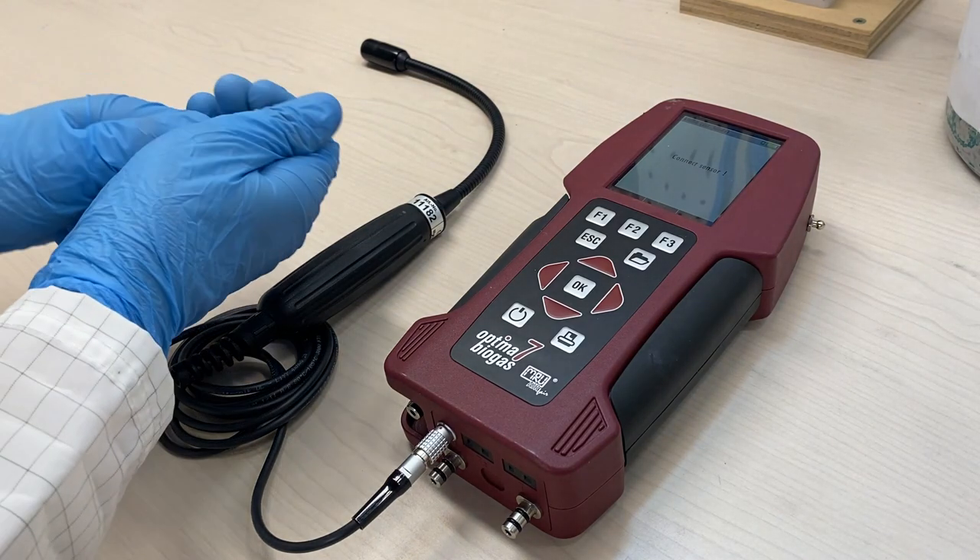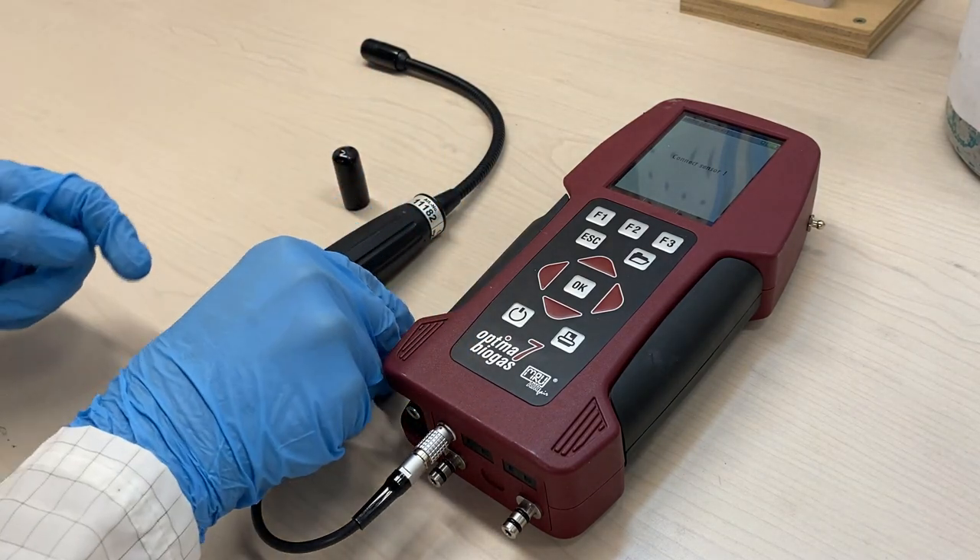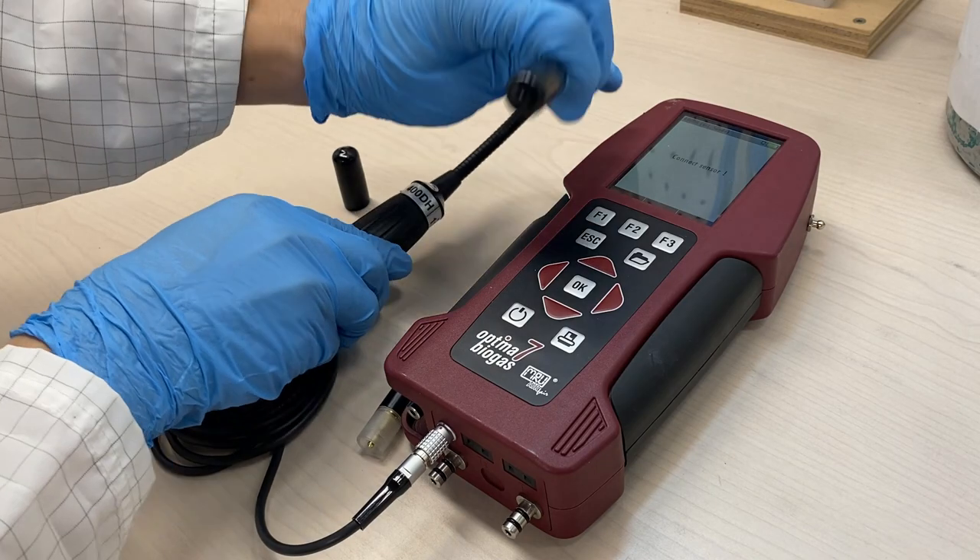Remove the protective cap from the sensor and attach the jack end of the sensor onto the probe.